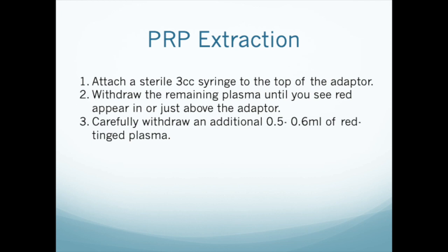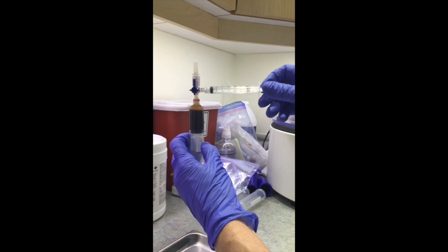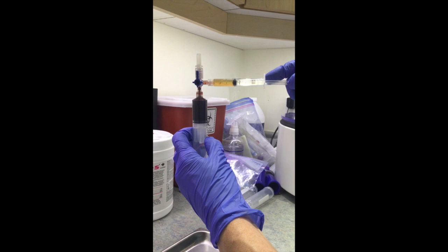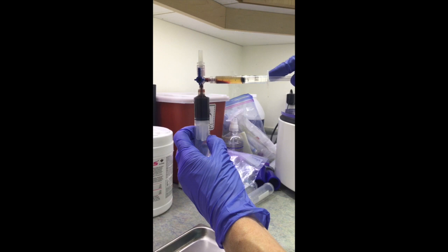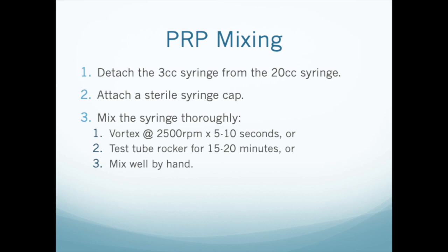Now attach a sterile 3 mil syringe to the top of the adapter. Slowly withdraw the rest of the plasma until you can just see the red appearing above the adapter in the tip of the 3 mil syringe. Then carefully withdraw 0.5 mils more of the red layer.